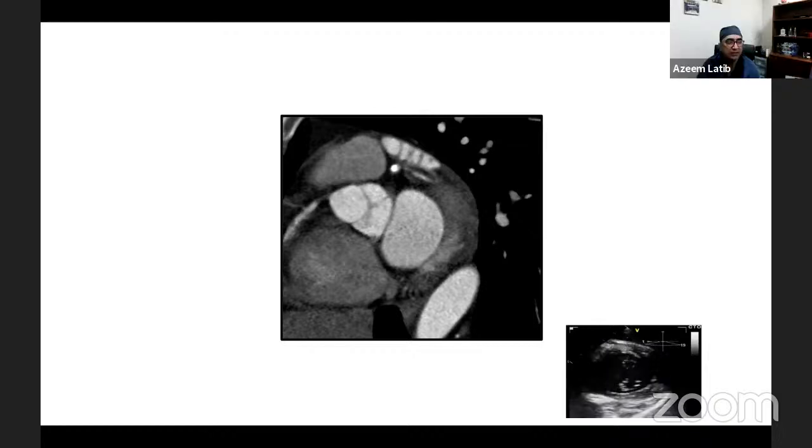Yeah, absolutely. That's why now with all my mitral cases, especially, I mean, for the MitraClip not as much, but if we're doing something more complex, like a valve or annuloplasty, once we're tenting, we always try and get a 3D again, and get a surgical 3D where you can see the valve, see the commissures, and see where your tenting is in relation to that. Because sometimes where you think you are is not what's optimal for that procedure and that patient's anatomy. Correct. Yeah, that's really important.